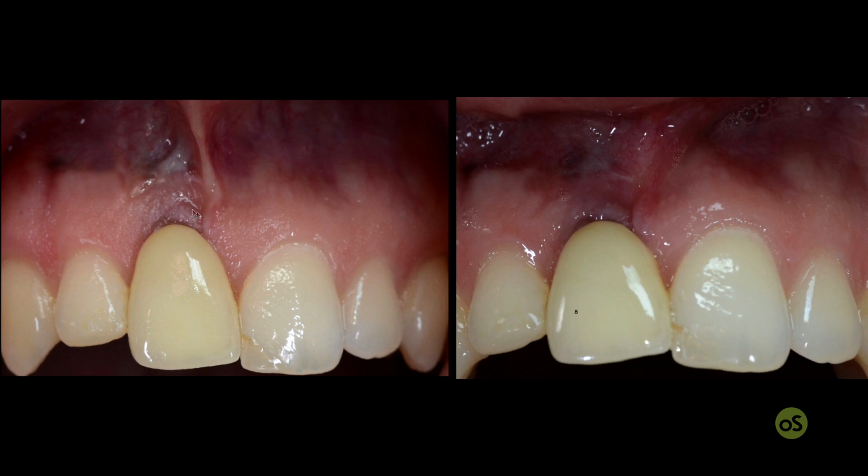And you see that some keratinized tissue, but even a lot of scar tissue was formed due to this procedure, but complete coverage was not achieved. And if I can tell you, maybe the length of the implant-supported crown is even longer with respect to what it was about 1 year before the treatment with the free gingival graft.